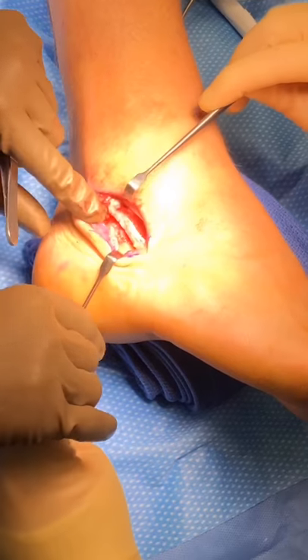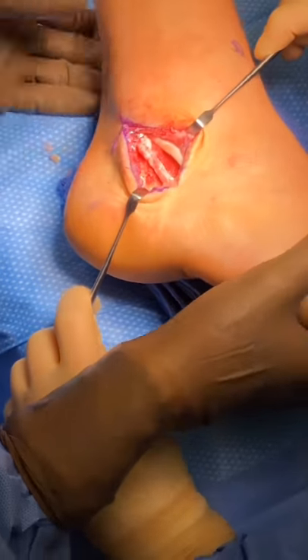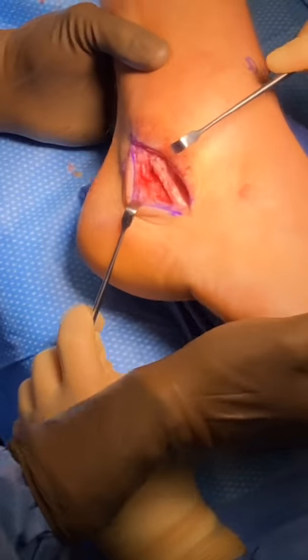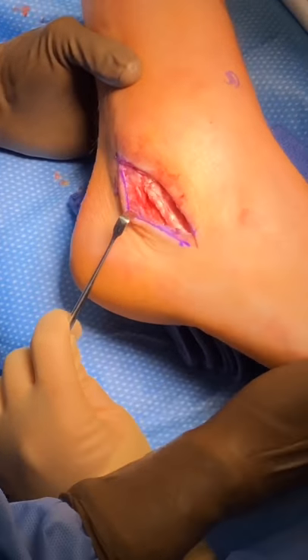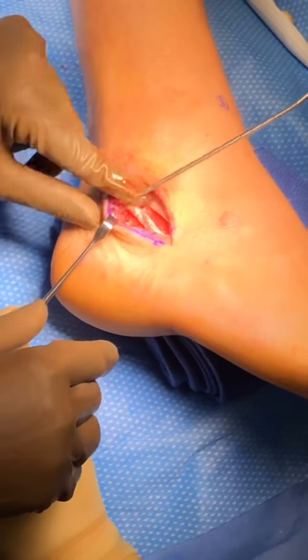Okay, so you can see the repaired tendon here. It's much better. You take the hind foot through a range of motion and it tends to glide pretty well, so you should be much better with that.